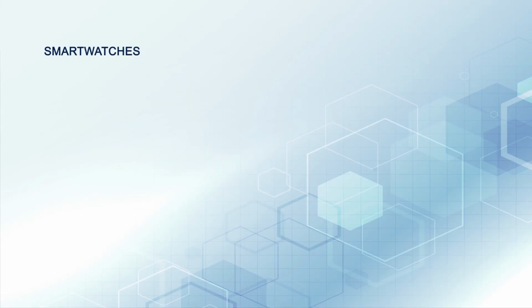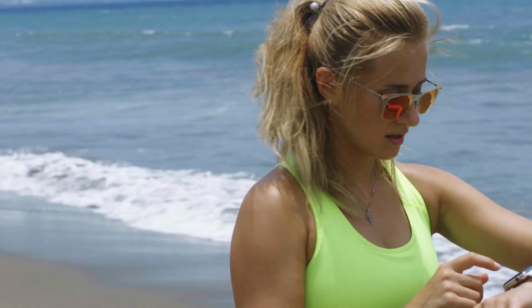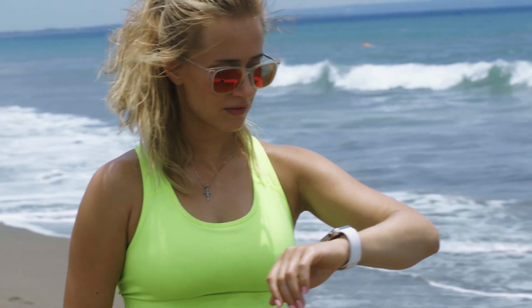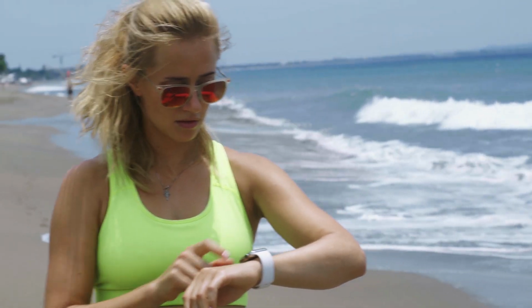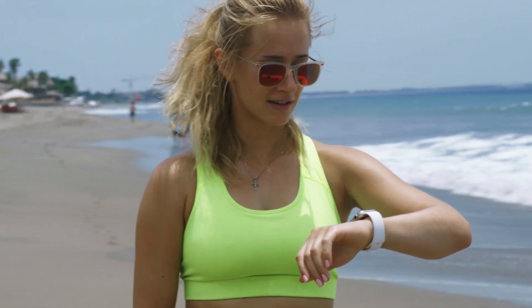A smartwatch. A smartwatch is a wearable electronic device designed to be worn on the wrist, offering various functionalities beyond traditional timekeeping. It serves as an extension of the smartphone, providing users with easy access to information, notifications, fitness tracking and other features right on their wrist. Smartwatches are designed to sync and communicate with smartphones, enabling users to stay connected and access essential apps and services without needing to take out their phones.